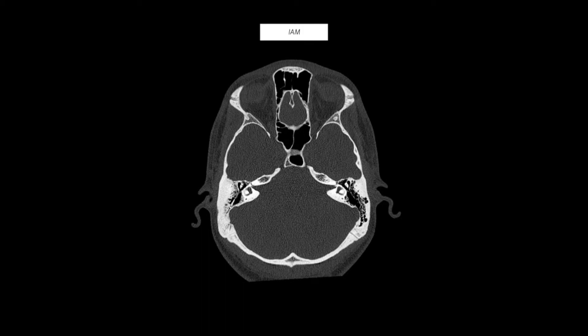If we go one step further cranially, we'll encounter two structures that look like open-ended triangles. Here on the left you can see part of the open-ended triangle, and here on the right you can see a similar appearance. These represent the internal acoustic meati. We'll talk more about the contents of these canals or foramina in a later video where we discuss temporal bone anatomy, but there are some important nerves that enter into the internal acoustic meati at this level.